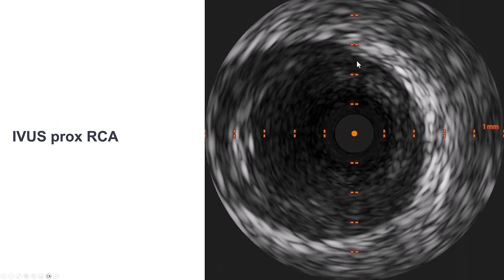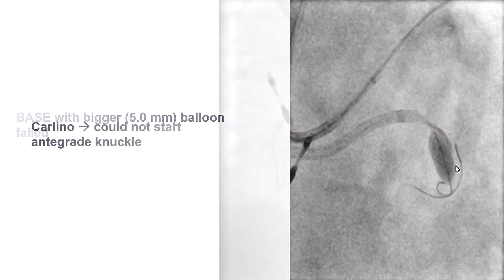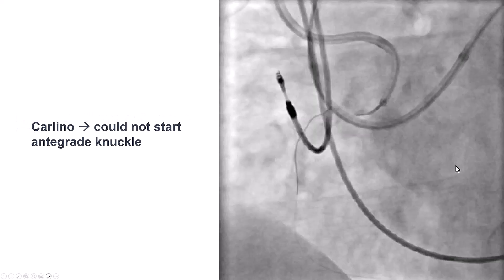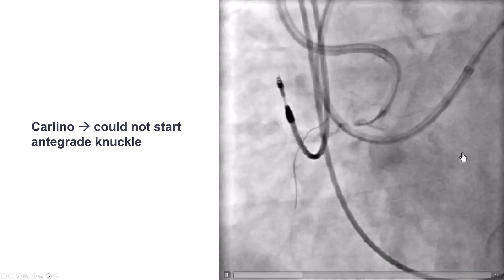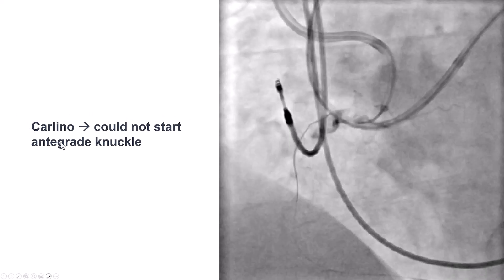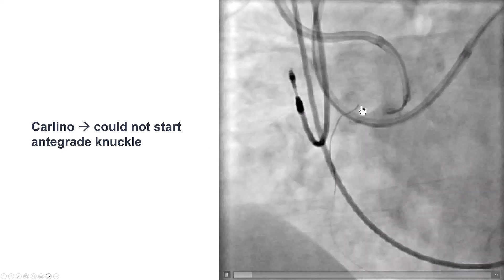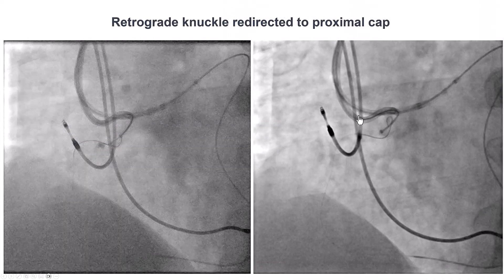We saw that this was a large vessel — almost 5 to 6 millimeters in diameter — so we used a bigger 5.0 mm balloon. Once again, we were unable to get through. We advanced the microcatheter and attempted an injection using the Carlino technique, but once again we were not into the extraplaque space.